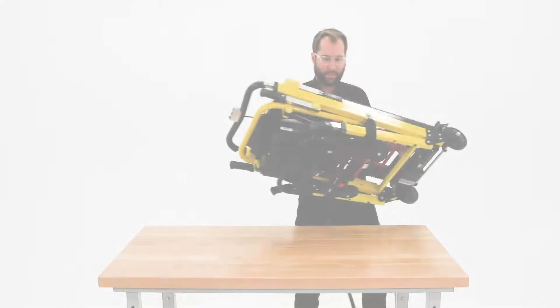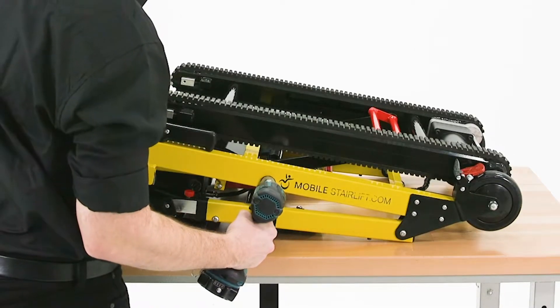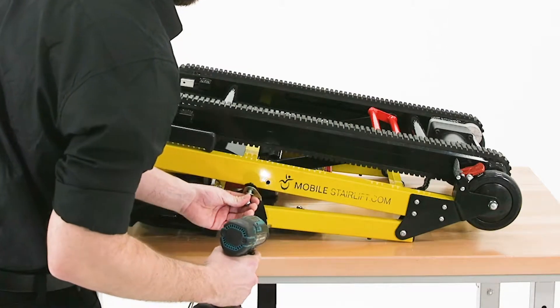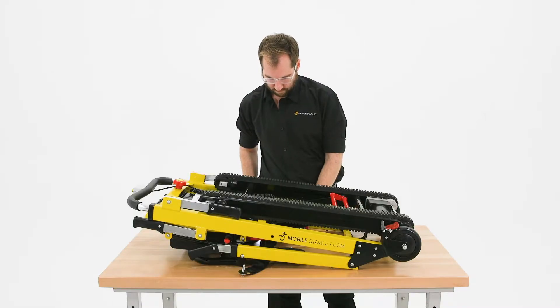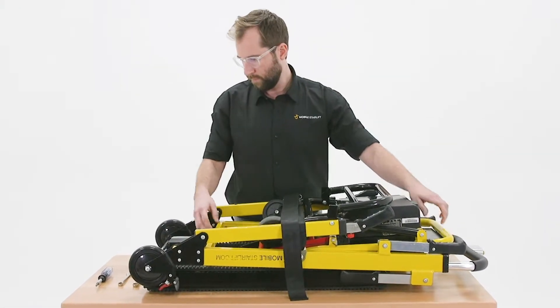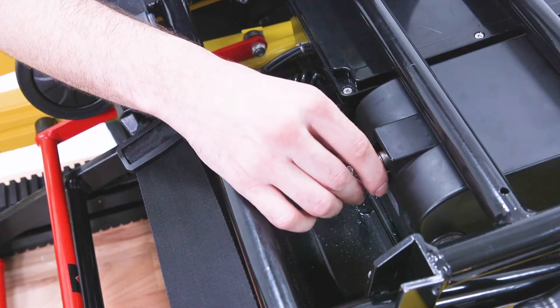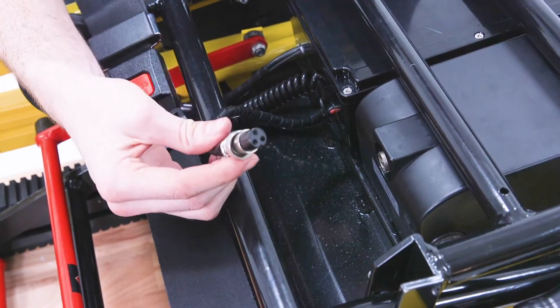First, place the stairlift on your work surface with the tracks facing up, and use the screwdriver to remove the bolts that fasten the seatbelt's metal bolt plates to the main frame of the chair. Then place the folded stairlift on your work surface with the tracks facing down, and unscrew and remove the cord which connects the battery to the motor.